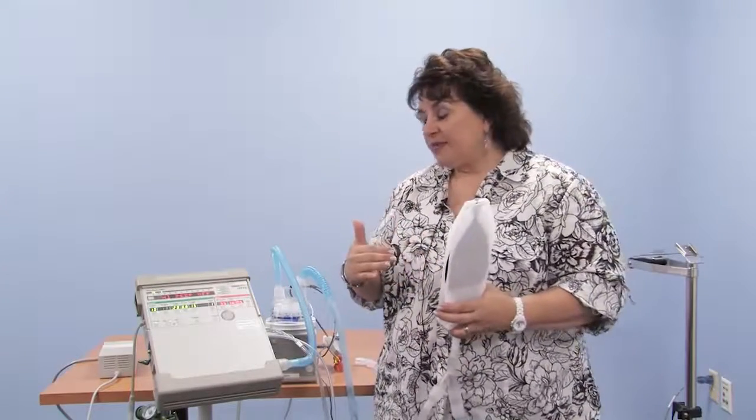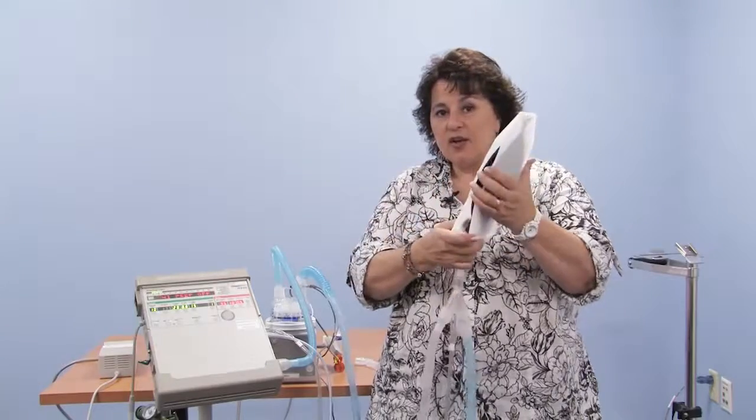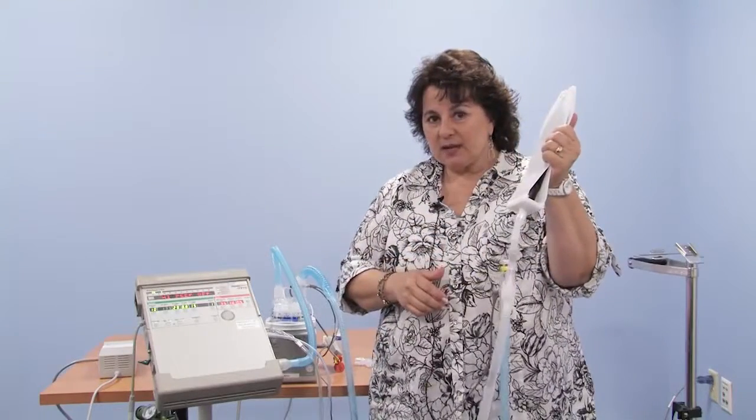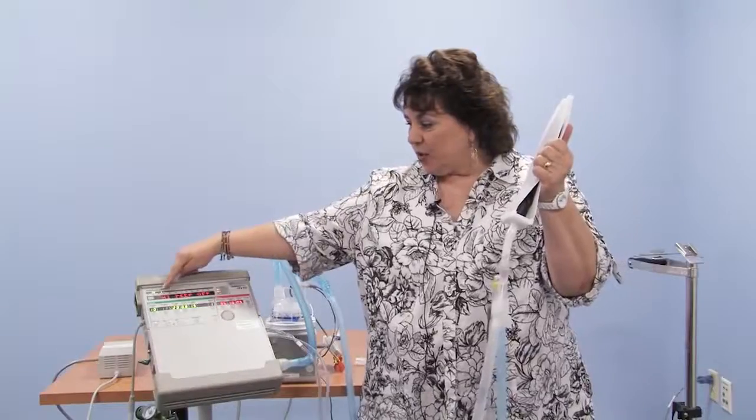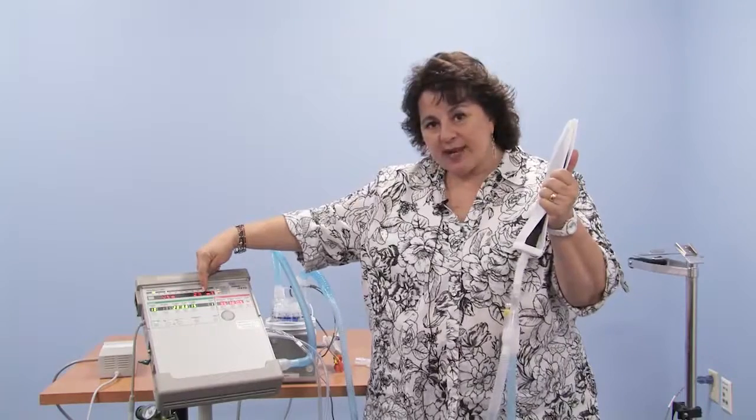The ventilator is told to go up to 20 and down to 5 of PEEP, or up to 15 and down to 5 of PEEP for pressure support breaths. And the ventilator is going to go up to those numbers regardless of whether the air actually makes it into the lungs. So if I don't let the air into my lungs, it's still going to go up to 20 and down to 5. But there won't be much air given to the patient. And that's where you can see the VTE, or tidal volume, go down, down, down.